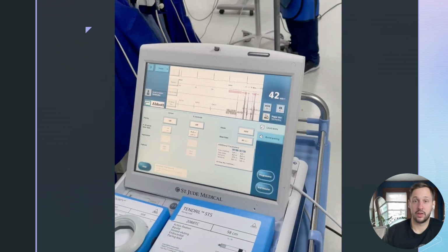All right, so as promised, I will try to keep my commentary to a minimum, but I will highlight the important parts here. And we'll go through it one last time.